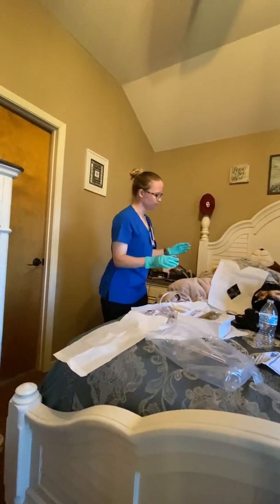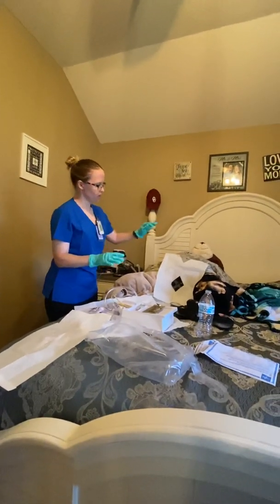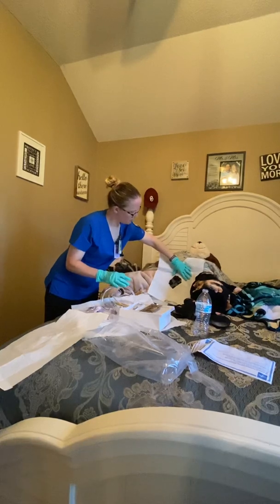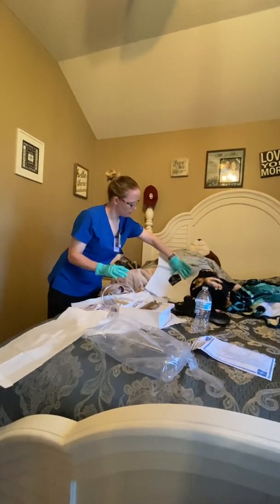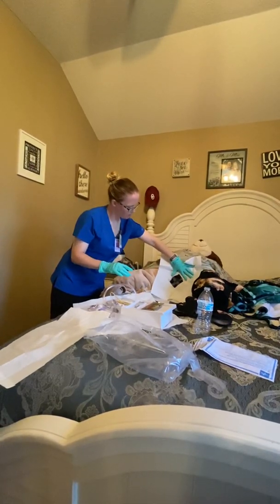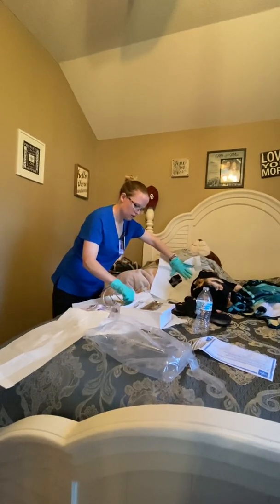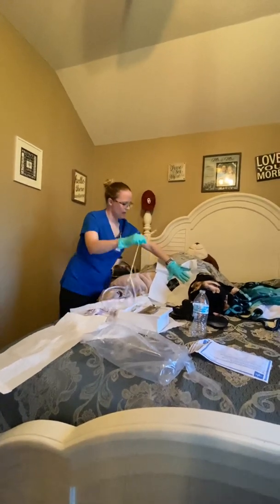With the female, we use our non-dominant hand, and we're going to separate the labia. Now this hand is contaminated, so you have to keep this hand here. You're going to make sure that you're able to see the urinary meatus. That's the one on top. You're going to grasp the lubricated catheter.